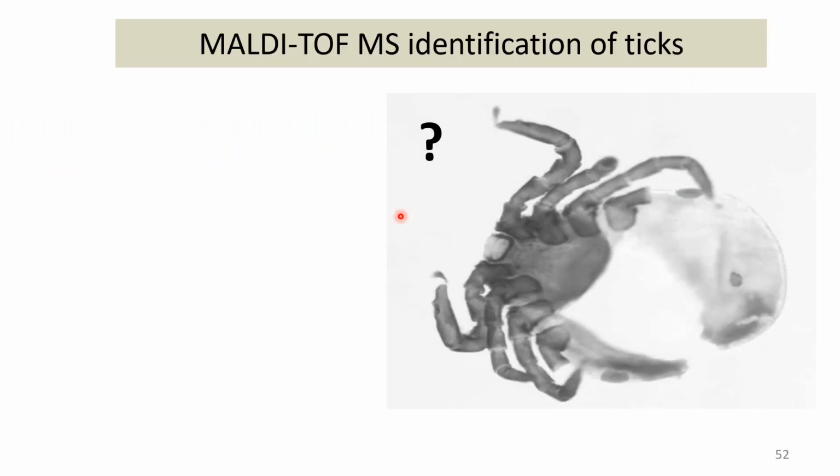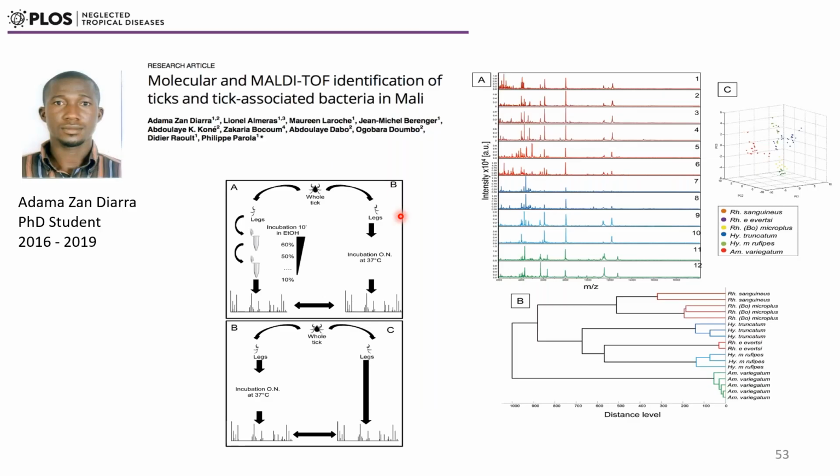So you can see you can end up in this kind of situation when you get a sample that is so damaged that even the greatest entomologists can't do anything with it. Here the head is missing, and the head is really a major body part for tick identification. And it turned out it was Ixodes ricinus, which I just mentioned is a major vector. So it was really important to know what kind of tick we were dealing with.